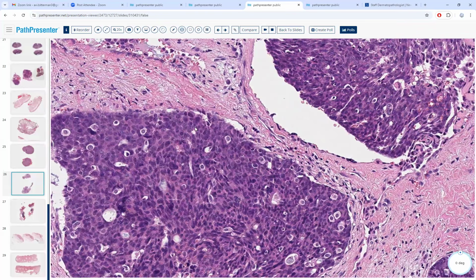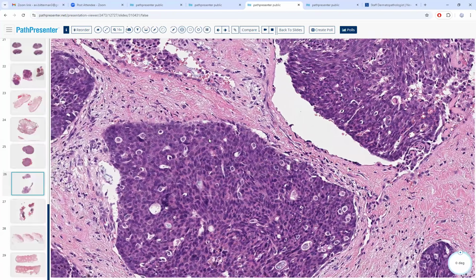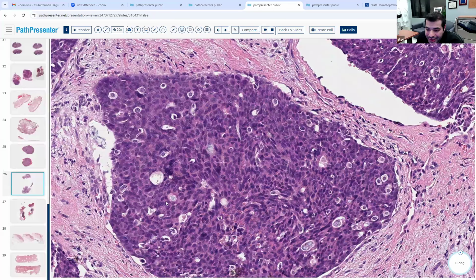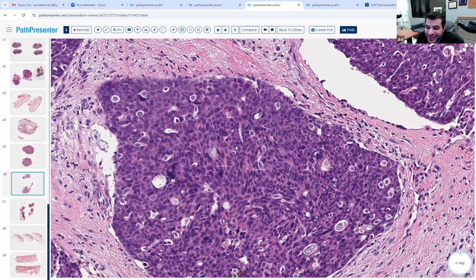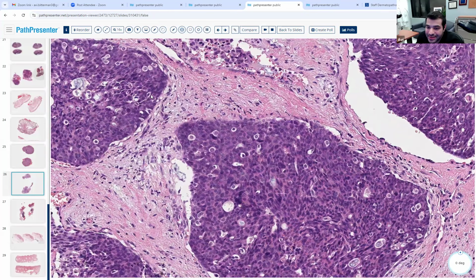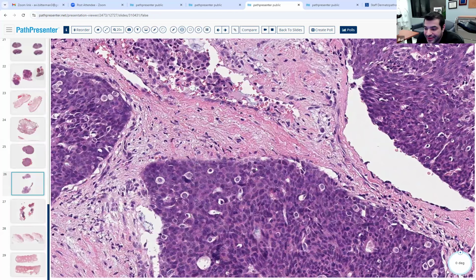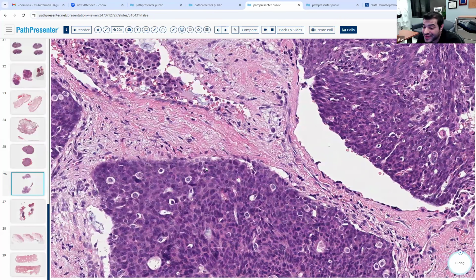It doesn't look like there's a reaction in the stroma, and also you have those little kind of looks like maybe ducts. So there's some adenoid component to it, and you can see that in BCCs. Sometimes you can see this cribriform adenoid type of look in basal cell carcinomas. So that actually also can go for BCC. So it's tricky. This can be a trick.